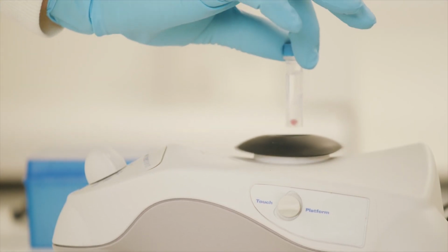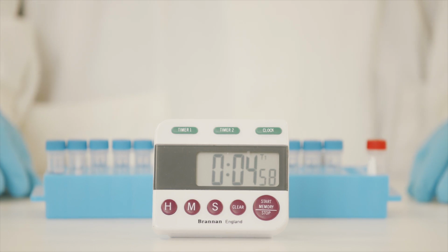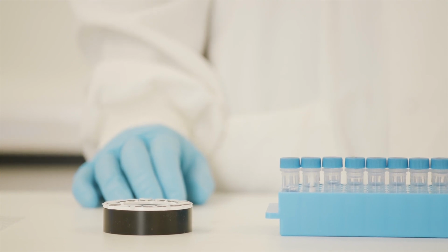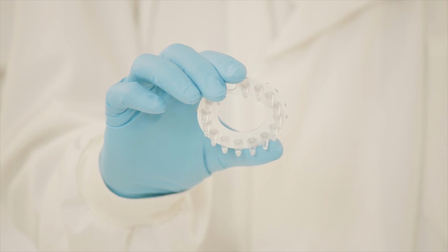After capping, the sample tubes should be vortexed thoroughly and then left at room temperature for 5 minutes to complete viral inactivation. The samples are now ready to be added to the MasterMix magazine. The magazine should be quickly flicked down as demonstrated to ensure that all the liquid is collected at the bottom of the tubes.